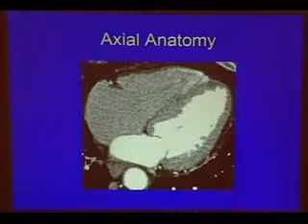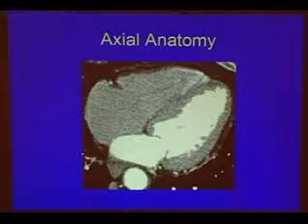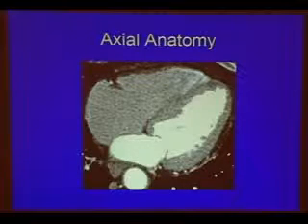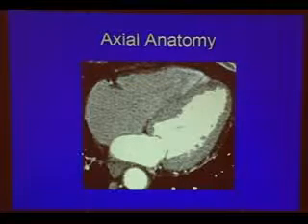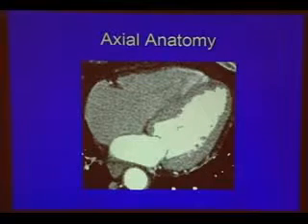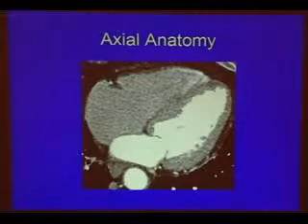And we can also do moving pictures of the heart, where we can actually evaluate the motion of the muscle of the heart, which many times we're able to determine if the patient has had a significant heart attack with damage to the muscle, or maybe there's just ischemia to the muscle, especially when the patient is stressed.